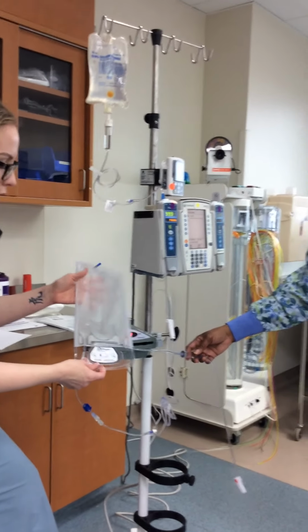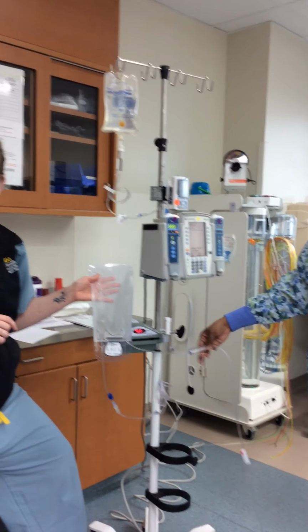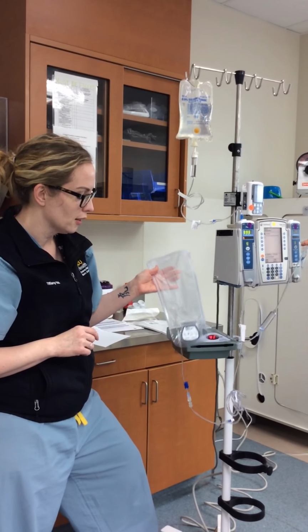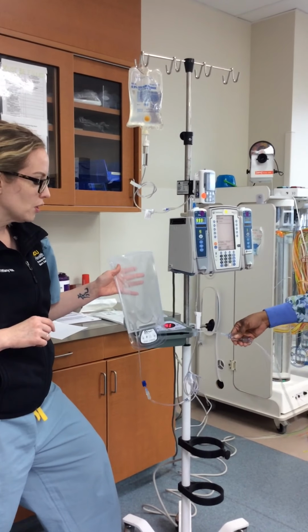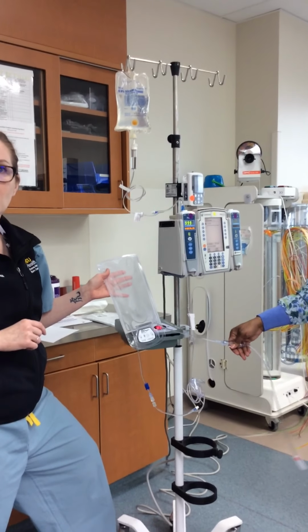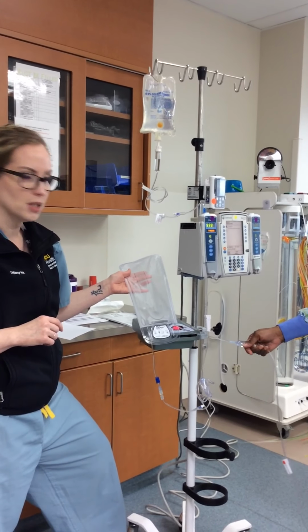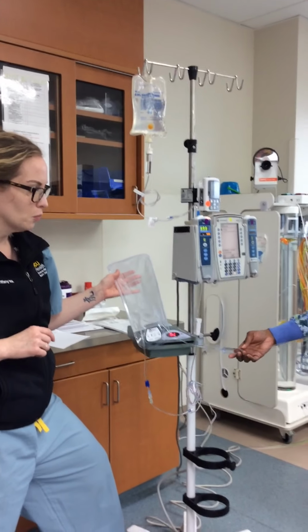For how long this can be used, you can use these cassettes as long as you would use any hospital tubing. So once it is expired, you need a new cassette and just change out all the tubing. You can also use this fluid warmer to administer blood. So you can give some heated blood through this. It's the same setup process and the same tubing rules that you would use for administering blood.